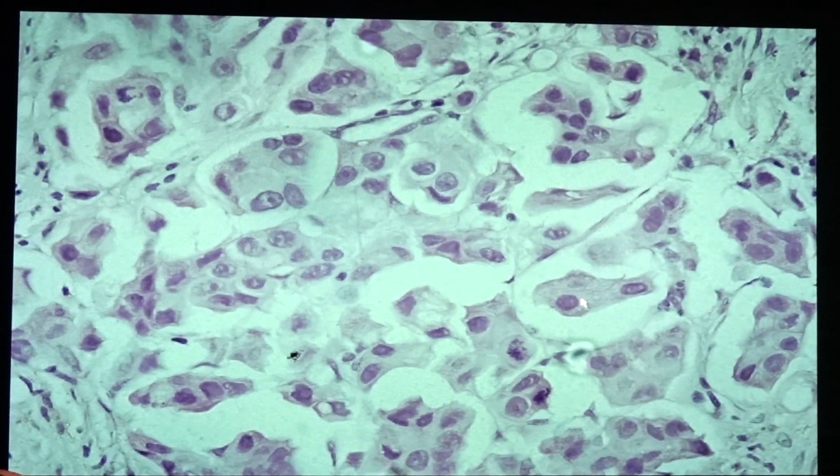So any patient who would be HER2 positive would be eligible for trastuzumab, and they would account for 20% of the population. And there is the so-called triple negative, wherein the ER is negative, the PR is negative, and the HER2 is negative. So they would account for 15% of the population. Okay, so again, we try to look at the slide.